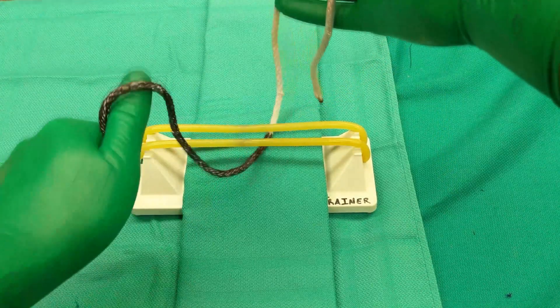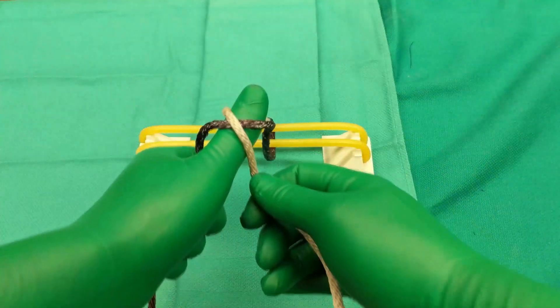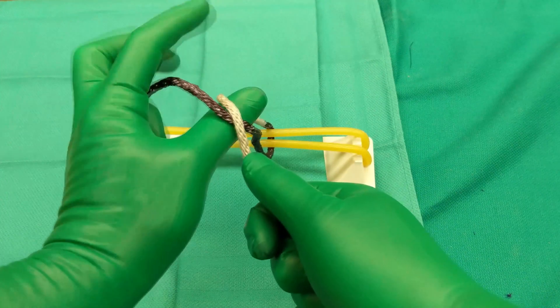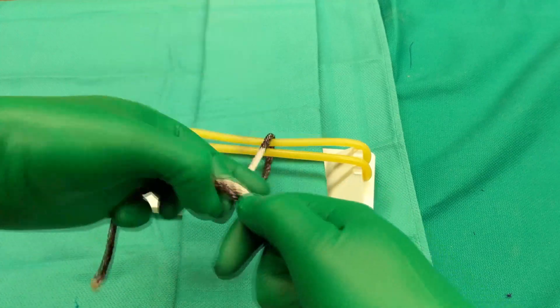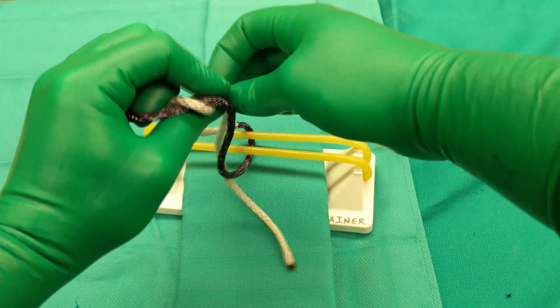You'll rotate your wrist to sweep that strand up on top of your thumb. Then your opposite hand crosses the opposite strand to make an X on the back side of your thumb. Then you make an OK sign with your index finger and thumb. Rotate your wrist forward so that you can then pinch that opposite side and pull it through that loop.